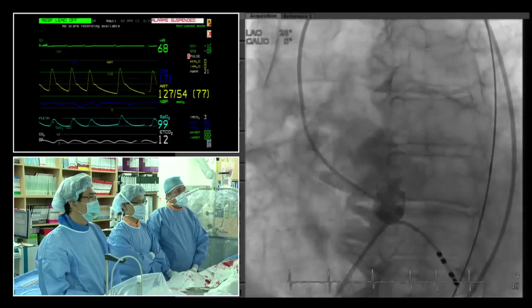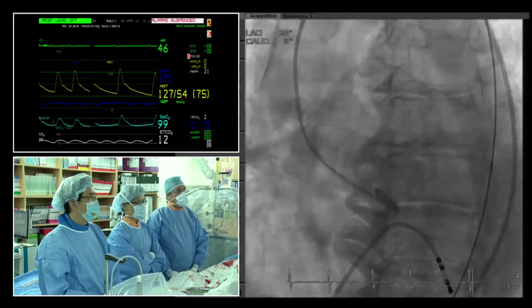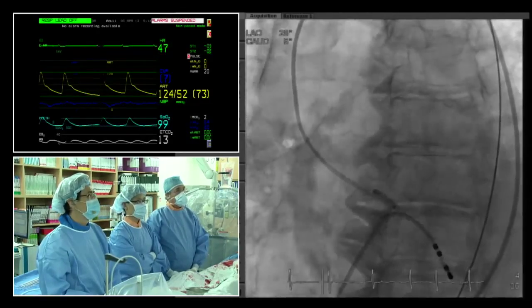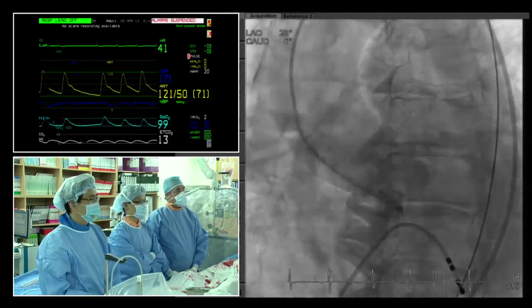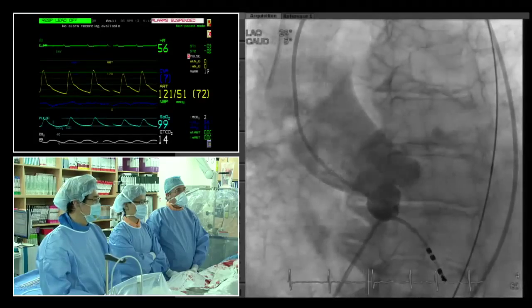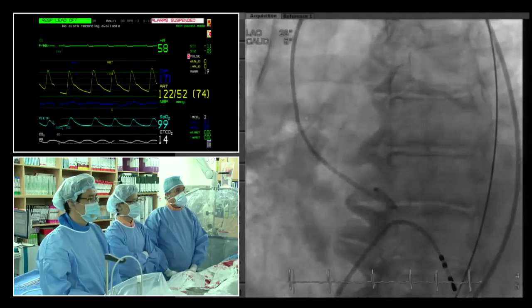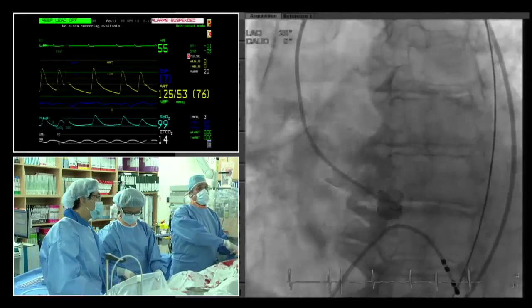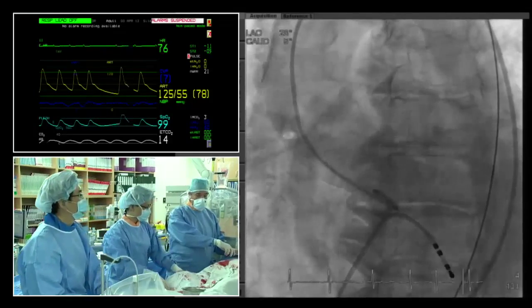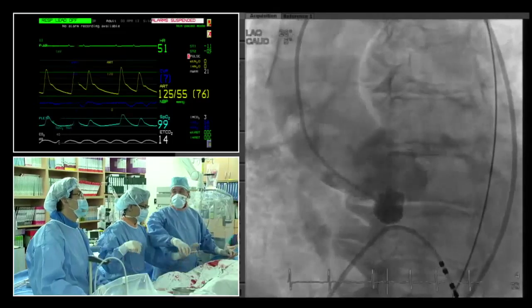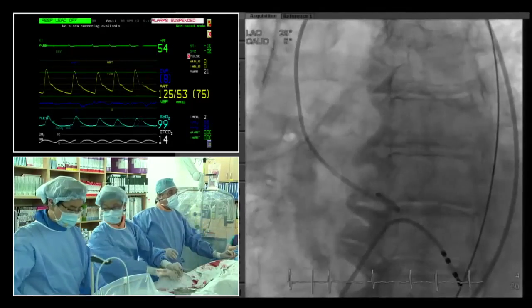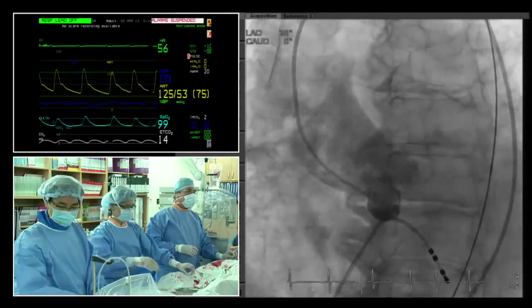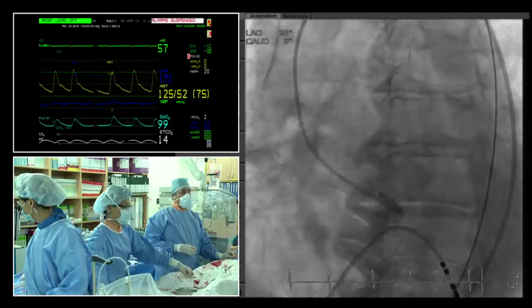Another panelist adds there are no concerns even with a Sapien valve at this level — the left main is really high and the left coronary cusp is not too calcified, so there is no concern for left main occlusion. The team confirms they will proceed without predilatation. During deployment, at two-thirds or slightly more of implantation, they will perform an angiogram in the projection that best shows the coronary ostia to confirm adequate distance between the frame and the ostia.